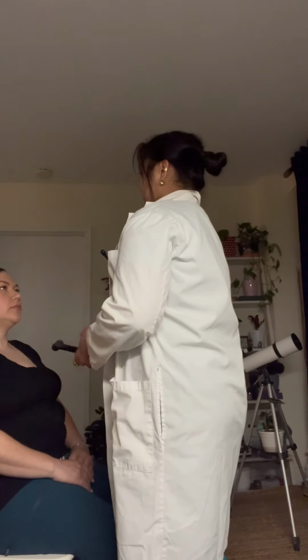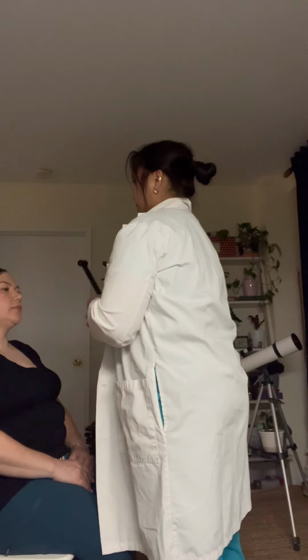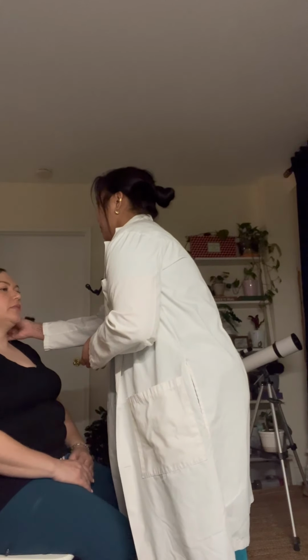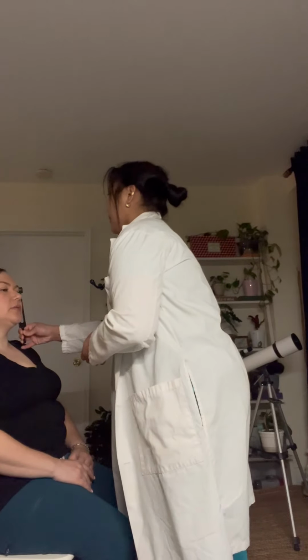Now I will be conducting the Rinne test. Do you hear the sound? Yes. Let me know when it stops. Stop. Okay. Do you hear the sound? Yes. Let me know when it stops. Stop. Okay. I'm going to do it on this other ear as well. Do you hear the sound? Yes. Let me know when it stops. Now. Do you still hear the sound? Yes. Let me know when it stops. Stop. Great. Air conduction is greater than bone conduction bilaterally.